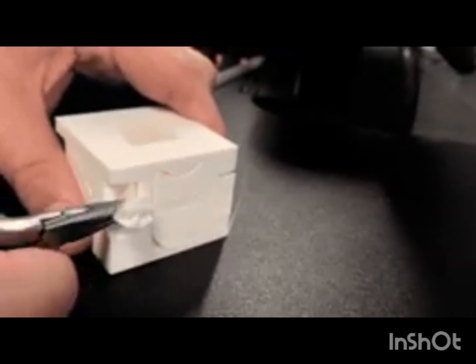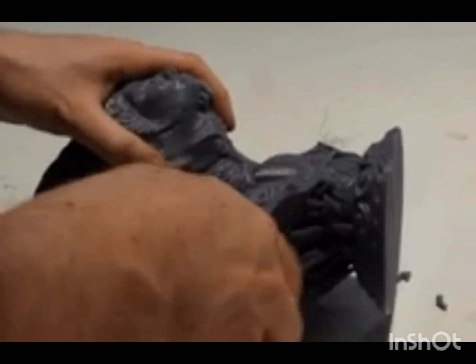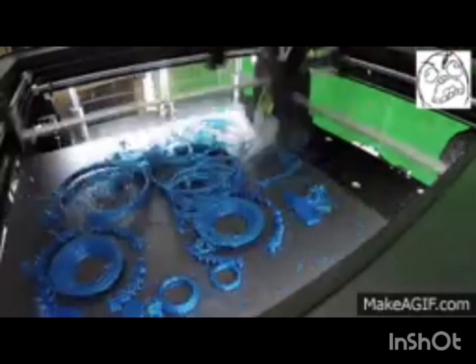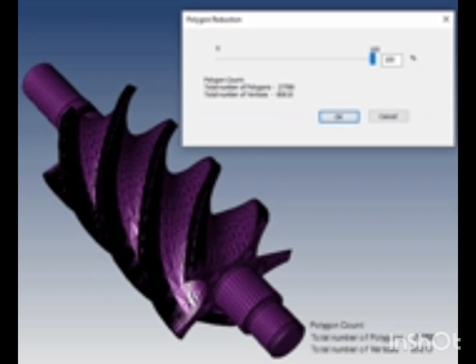Some common mistakes that occur while adding supports: too few supports, supports on occlusal surfaces, supports on attachment areas, incorrect model orientation, very thin supports, very thick supports, unsupported islands, failure to inspect auto-generated supports, and ignoring print preview. Most failed prints are caused by poor support placement rather than printer defects.